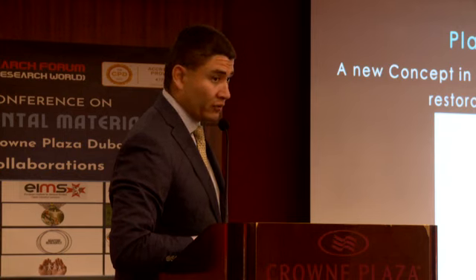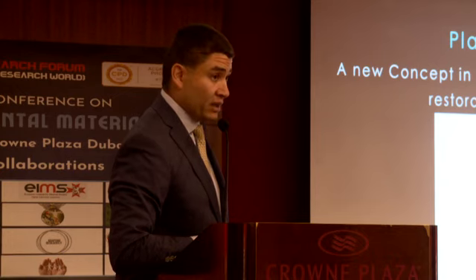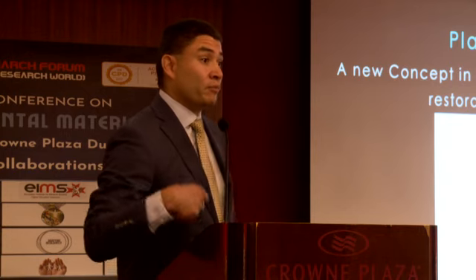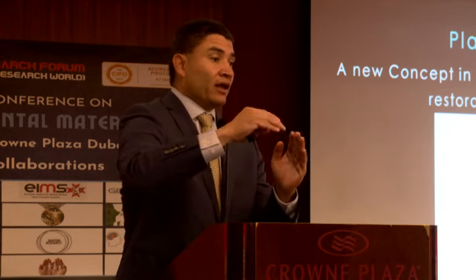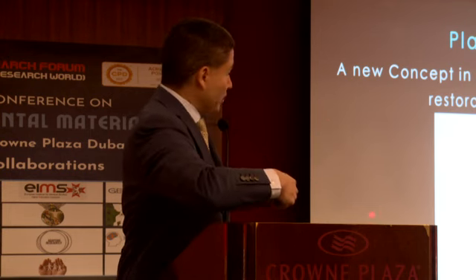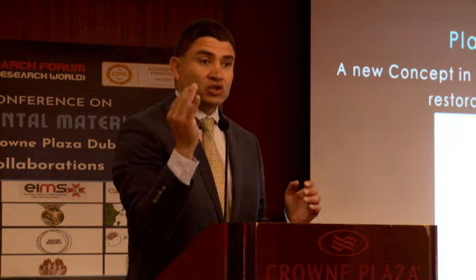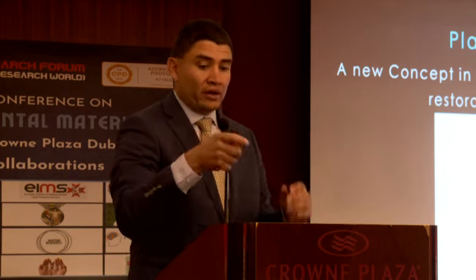You already know that, right? Now, that means that if you put this platform to the inner aspect in here, you can probably cheat the system and create more soft tissue thickness to protect the bone remodeling. The only reason why we lose this bone, remember, is because the bone is exposed and needs to be protected. It needs more soft tissue protection from going away, right?